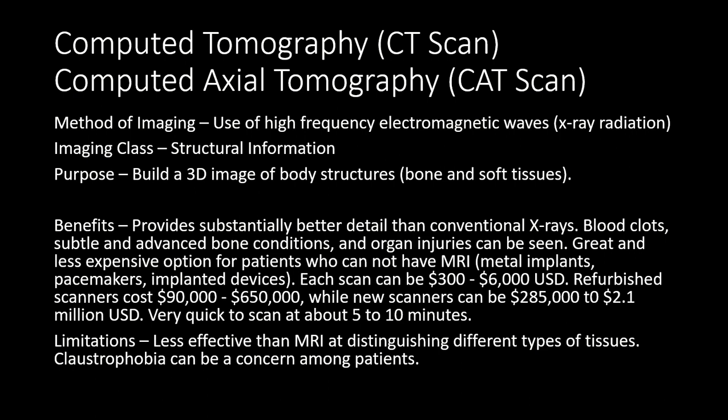Each scan can be costly at about $300 to $6,000, and refurbished scanners can cost from $90,000 to $650,000, while new scanners can cost $285,000 to $2.1 million. They are very quick, though, when it comes to the scanning process, and the actual scanning can take about 5 to 10 minutes.